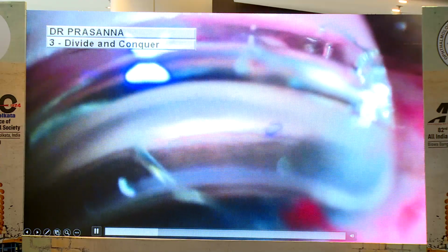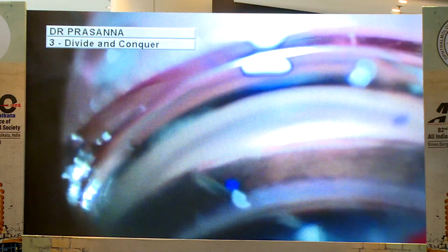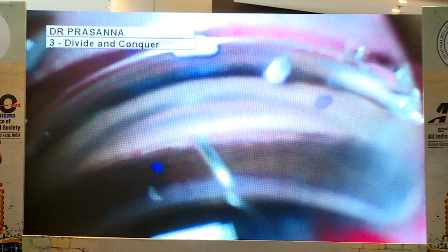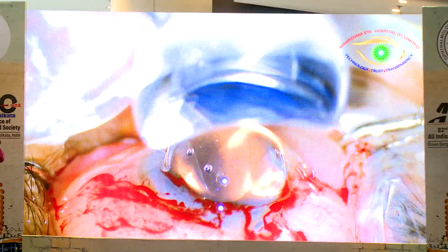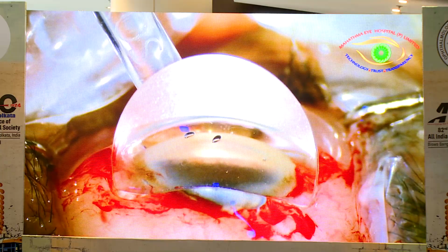So a lot of MIGS are now being the talk of glaucoma town. So how do we evaluate a MIGS? Because there is no particular marker and an ASOCT or a UBM is not high resolution enough to really go about it. But with Anterion, and I'll show you another surgery called KDB. So a 26 gauge needle is used for BANG. It's called bent ab interno needle goniectomy.